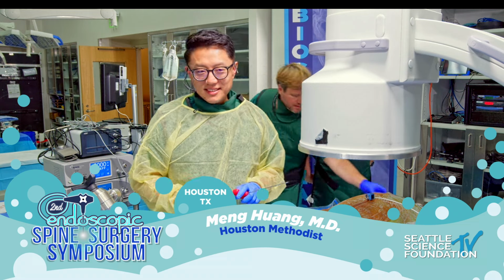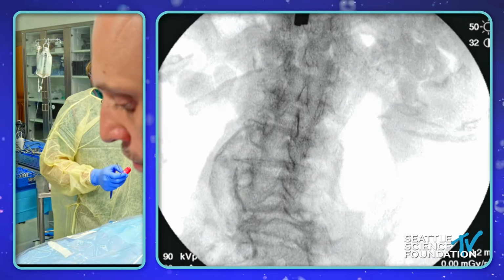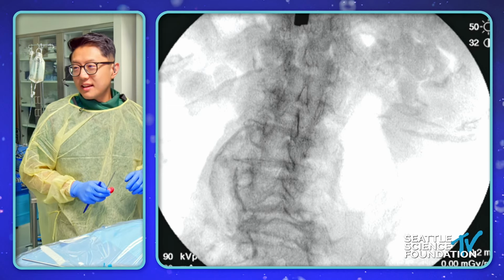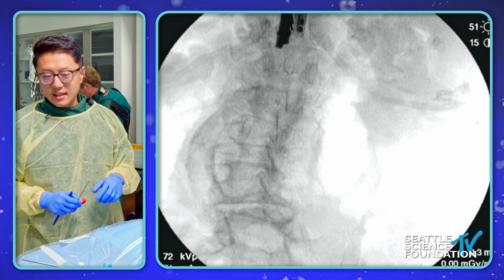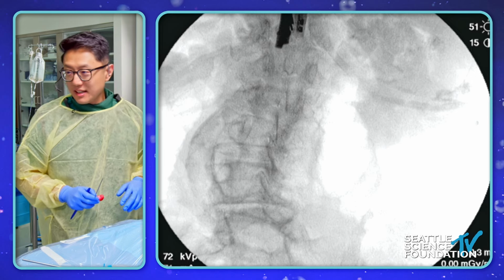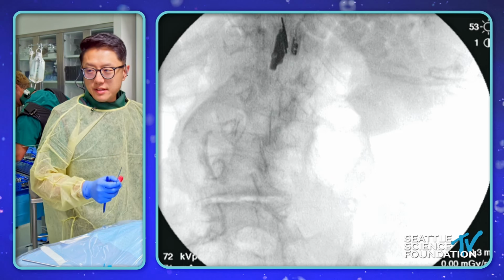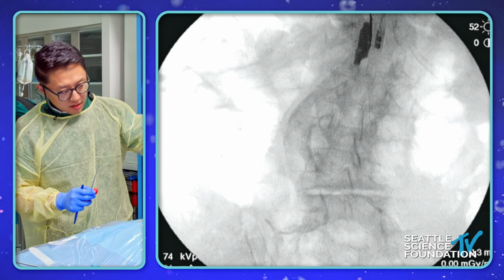Ooh, scoliosis, excellent. We did not want to make it easy. Yeah, you didn't want to make it easy on me. Okay, so let's tilt towards the head. Let's take a shot. Yeah, a little bit more. I don't suppose there's any way to rotate the bed, huh? No. Okay. All right. That's okay. Okay. That's great. And then let's center up a little bit. And then can we arc towards you?